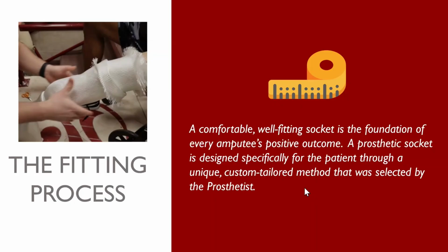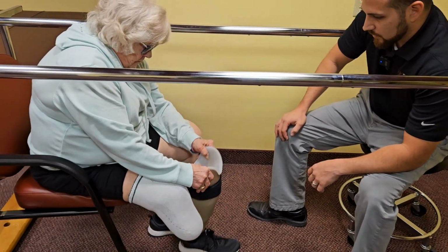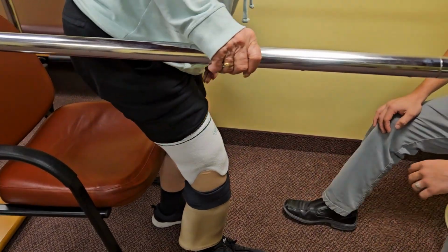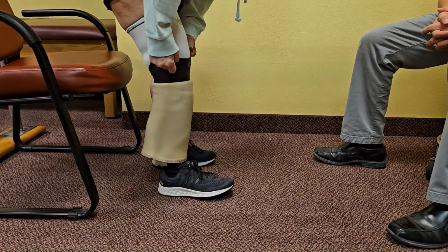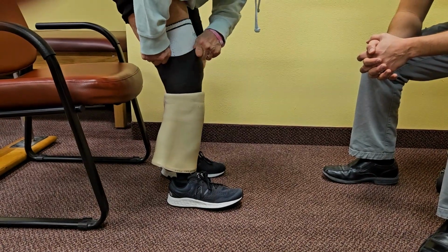It is the foundation of all outcomes, is how comfortable that leg is when you're standing on it, how much time you can put on it, whether it's causing nerve pain or discomfort. I don't care if it's whittled out of wood, made on a computer, or fabricated through a liquid laminate. No matter how it's done, it has to be comfortable, and it has to support the body. And it's first comfortable statically and then dynamically. So go ahead, you can move forward.